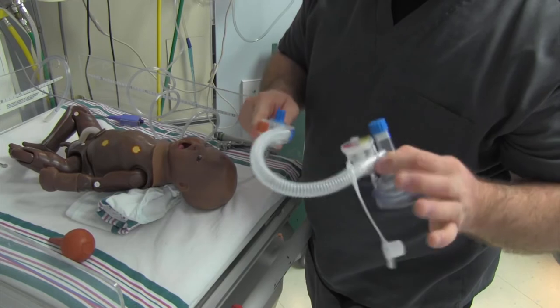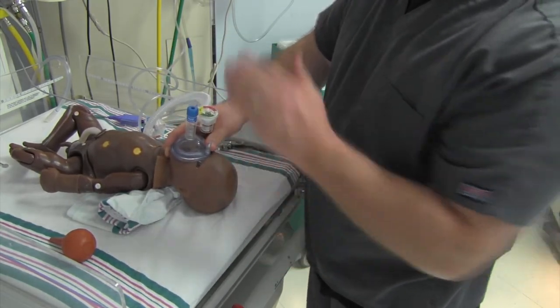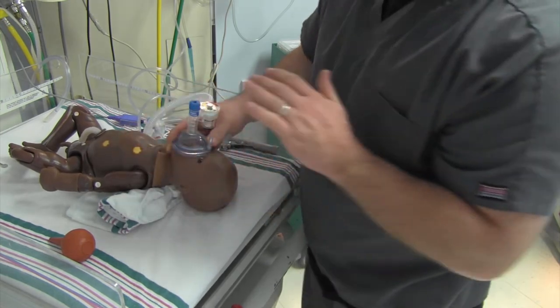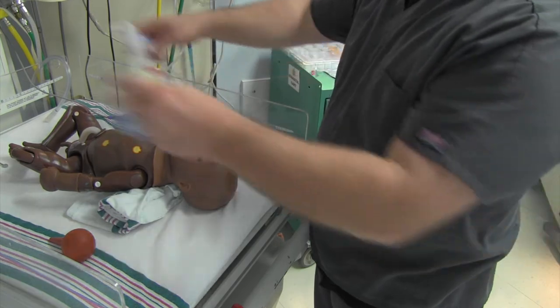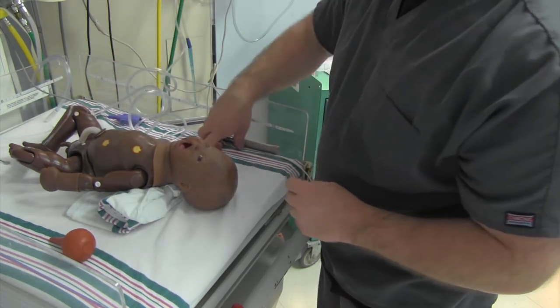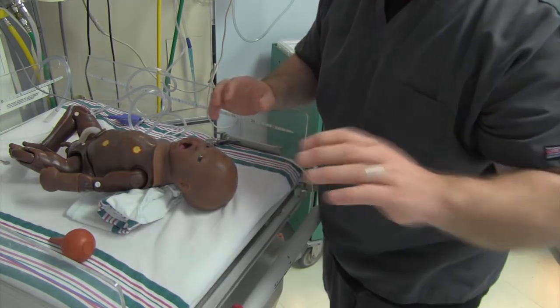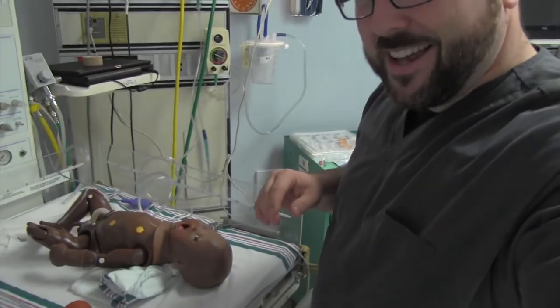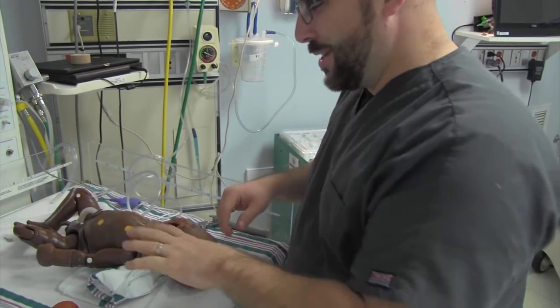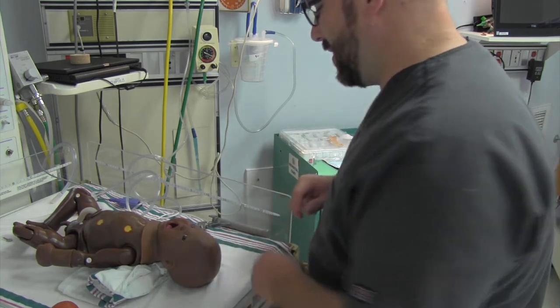If you learn nothing else - if you do really junky positive pressure ventilation, you're going to end up doing chest compressions and maybe drugs on a kid that didn't need it. So that's my soapbox on positive pressure ventilation. It's not just this easy - there's actually a lot to it. It's definitely not just simply squeezing a bag or occluding that. It's a vital part of neonatal resuscitation.